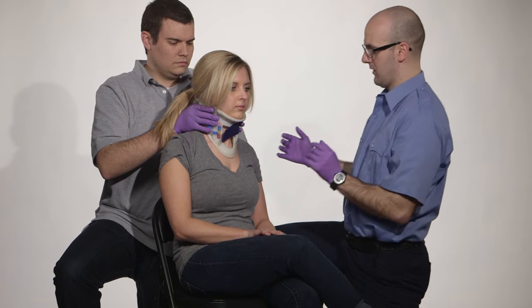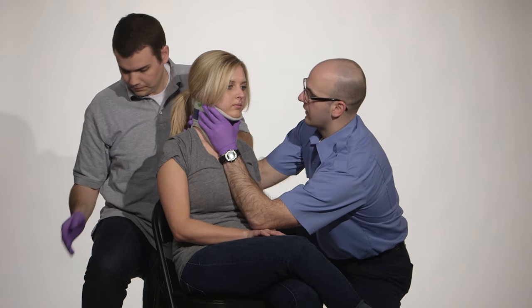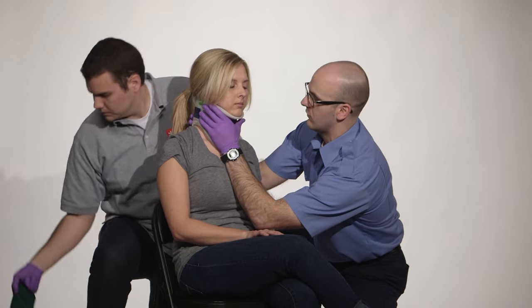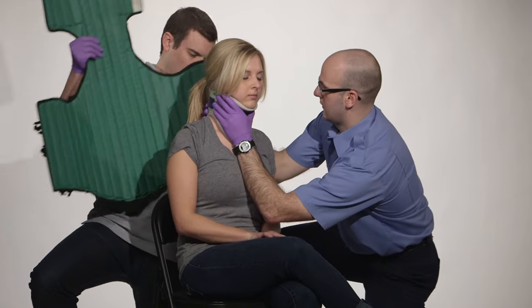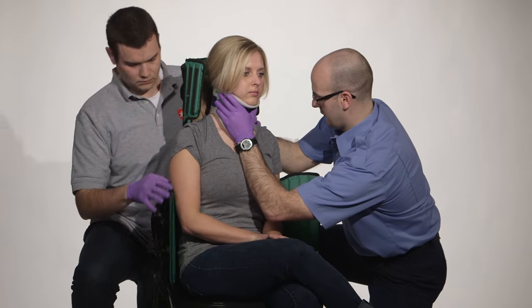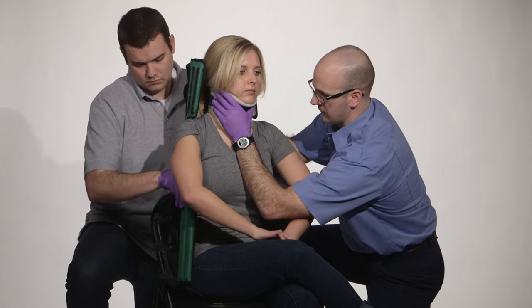So I'm going to take over C-spine. I have C-spine. What we're going to do is have you sit forward just a little bit, and my partner is going to put the KED behind you. So on three — one, two, three. If you can position that behind her and get those chest flaps up underneath her armpit as much as possible, that would be great.